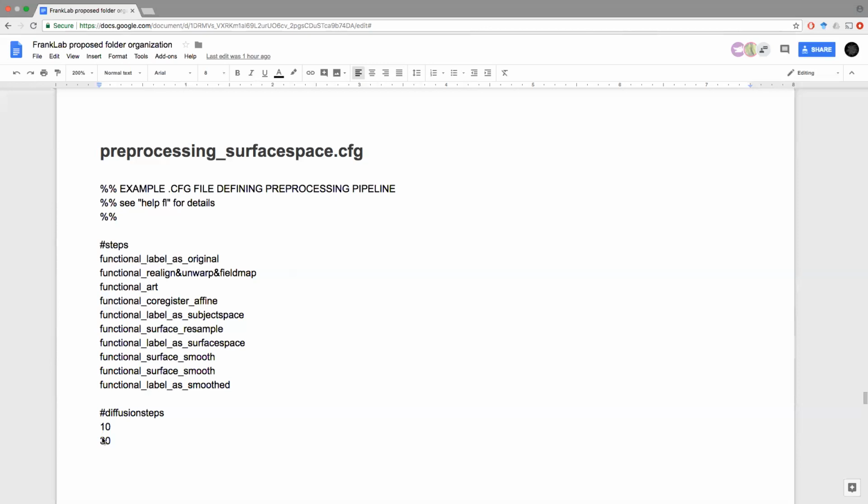At some point, I computed what this level of smoothing represented approximately, if we were to smooth the data using a Gaussian convolution, to give us a sense of how big these kernels were. Do you recall what these numbers were, Jason? I don't recall what the numbers were. I think this is very small, roughly like 4 millimeter smoothing, and this is relatively larger, like 7 or 8 millimeter smoothing overall. But I don't recall the exact numbers. I'll send you those numbers later on.